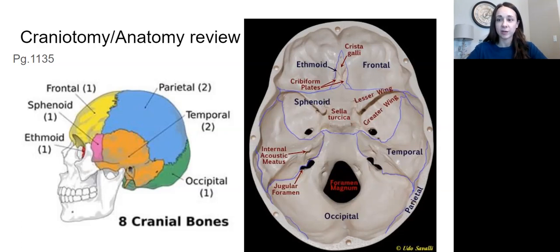They still might want that bacitracin to irrigate out the other tissues. So that's just the first layer they're closing, right? We did what we wanted to the brain. Now we're going to close the dura. Then we have to close the muscle, sub-Q, and skin. You got all those different layers. So after the dura is closed, you can use bacitracin irrigation, and most surgeons do, but you cannot use it on the brain tissue.